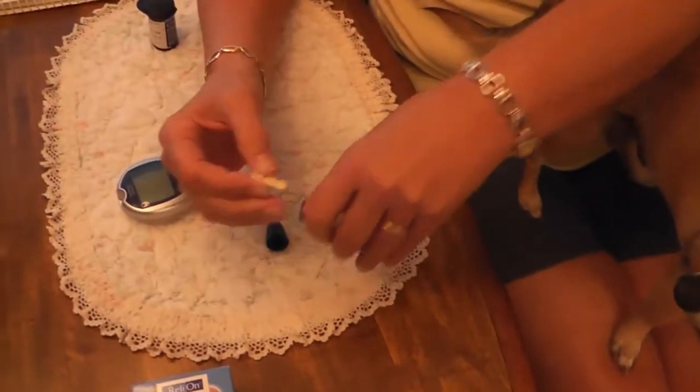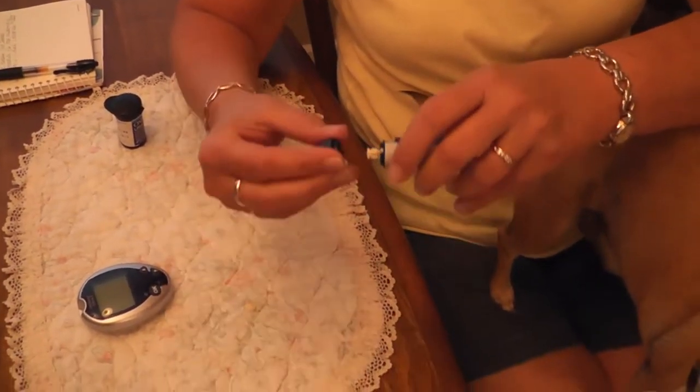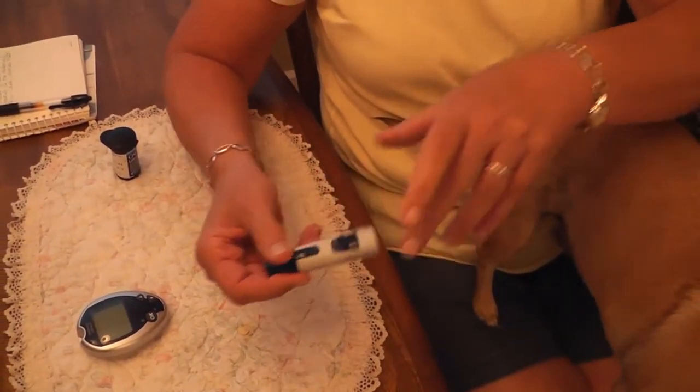They're thin lancets. What we're going to do is put it in the clicker. I've got it set on nine — the deepest it will go.